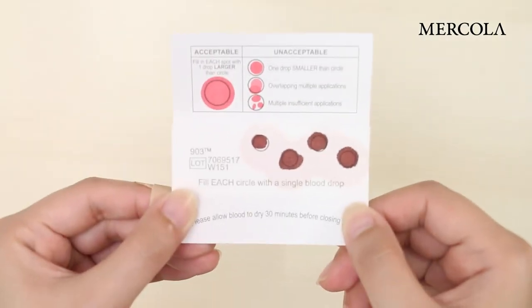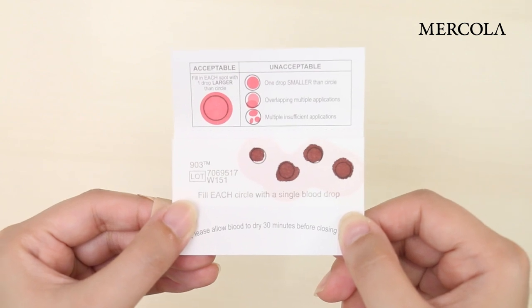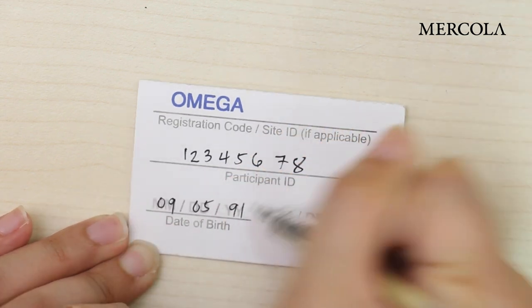You will know the blood spot cards are dry when the blood looks brown like this. Then write down your participant ID on both cards, together with date of birth and date of collection on each card.